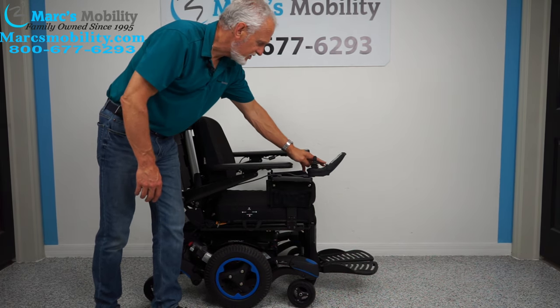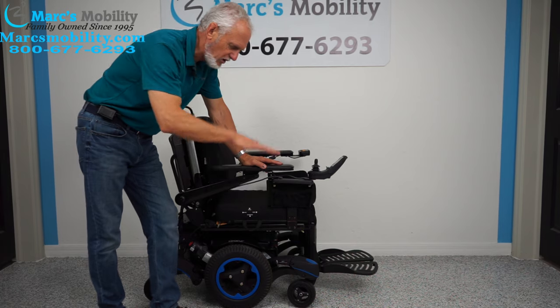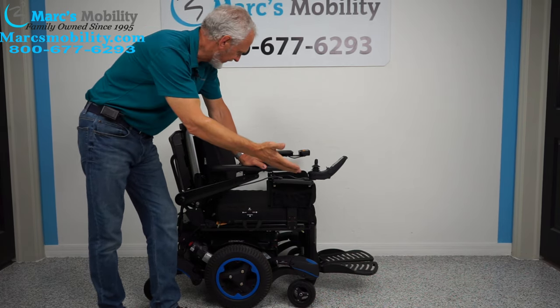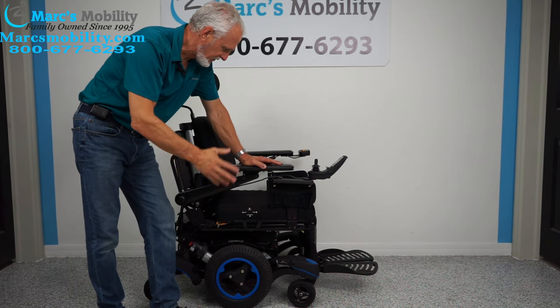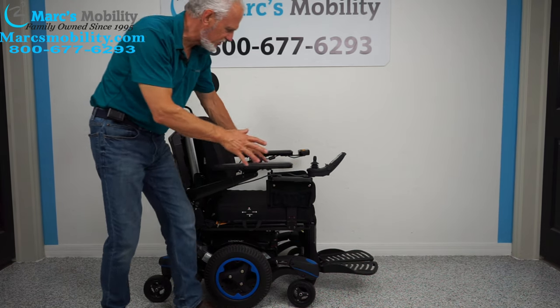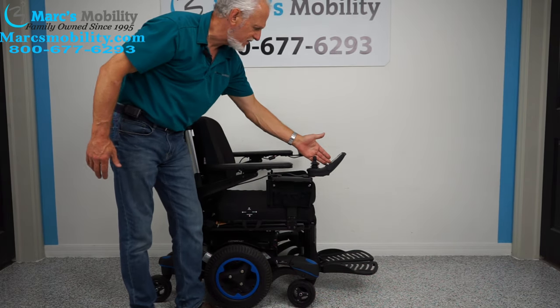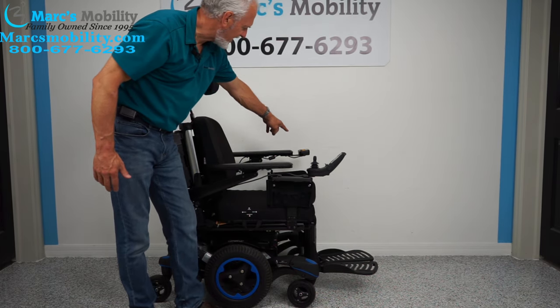This chair has a 12-inch seat lift, electric tilt, electric recline, and electric feet. You can operate all these features through the joystick or the switch box. Today I'm going to use the joystick because the switch box is on the left side.